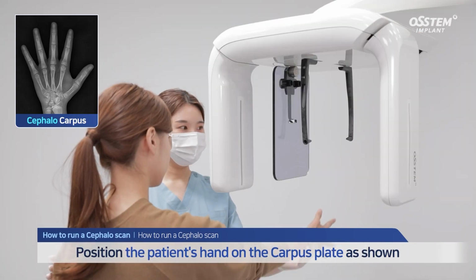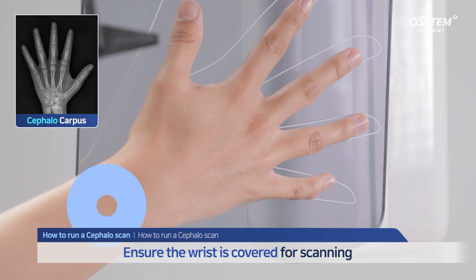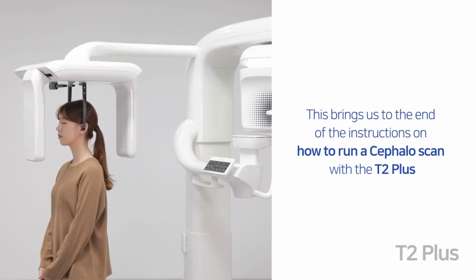When the carpus plate has been placed, put the patient's hand in the position shown on the plate. Ensure the wrist is covered for scanning. This brings us to the end of the instructions on how to run a cephalo scan with the T2 Plus.